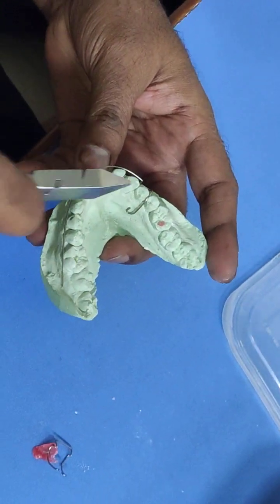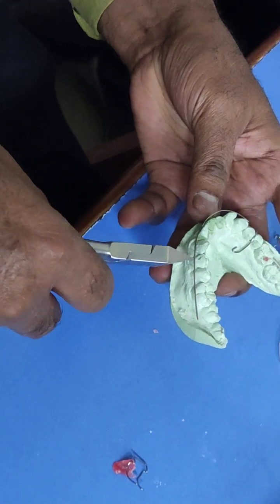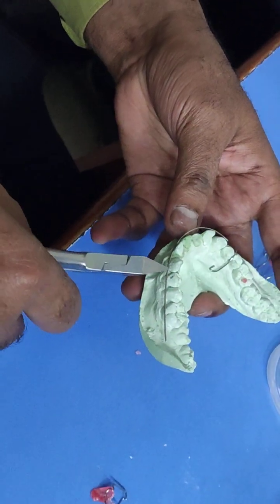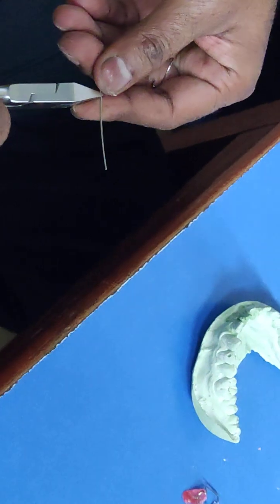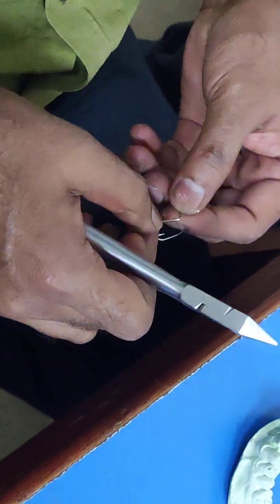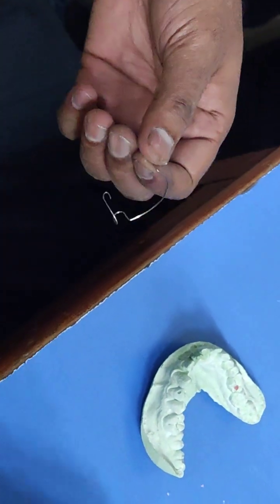Okay, so premolar here, although I made the bend, I made the bend at the wrong position. So again, premolar, keep it straight.